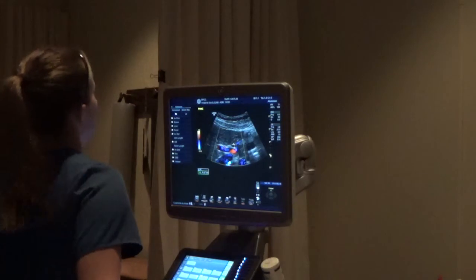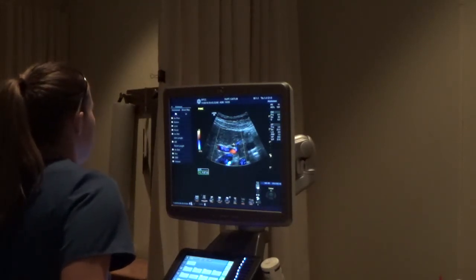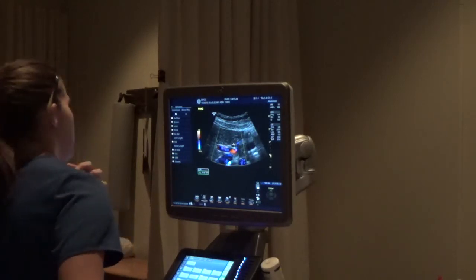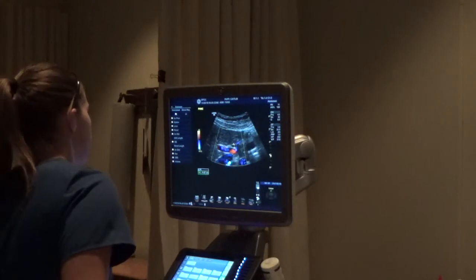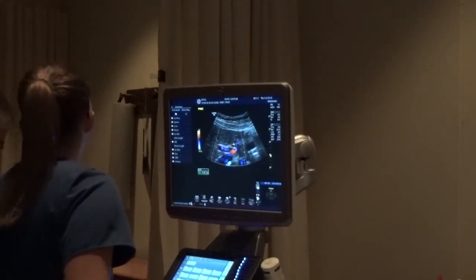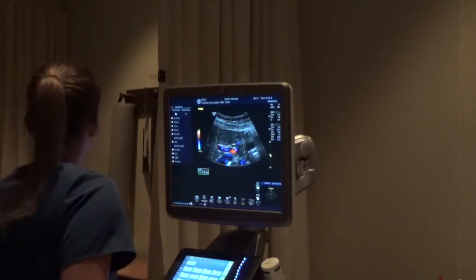If your patient's 47 years old and still has a gallbladder, what's the limit of the common bile duct? It's 1 millimeter per decade up to 6 millimeters. Okay, so 47 would be normal for her. Alright. I don't know if she's 47. She looks 35.